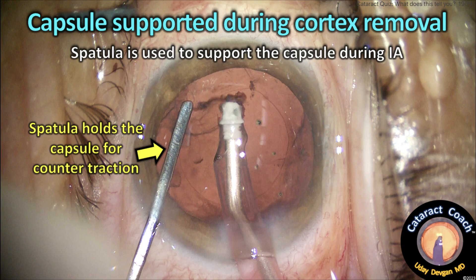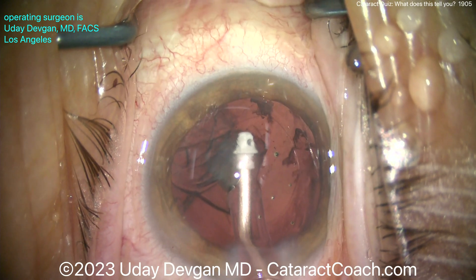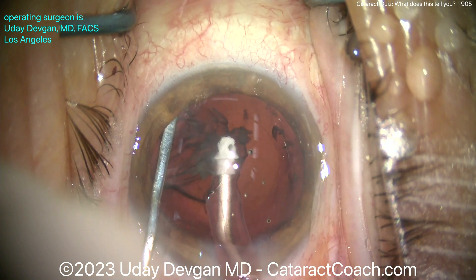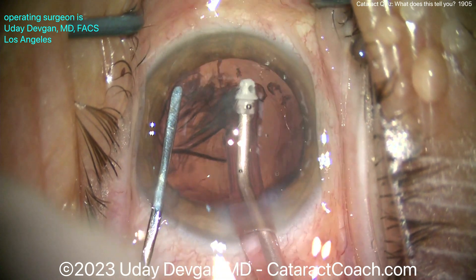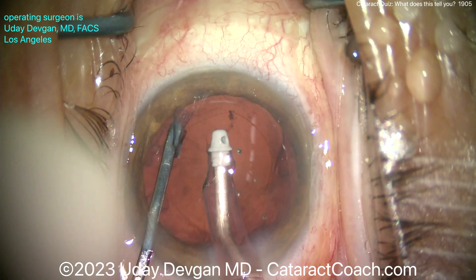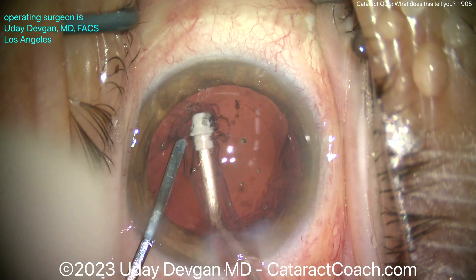What do I need? I need some counter-traction. Let's put a spatula or some other instrument in the eye — a chopper — something to gently retract and hold the capsule. You can also put a capsule retraction hook in, but you can just use your spatula. So before I pull this off, let's give counter-traction against that rhexis and slowly, very slowly, peel that off.